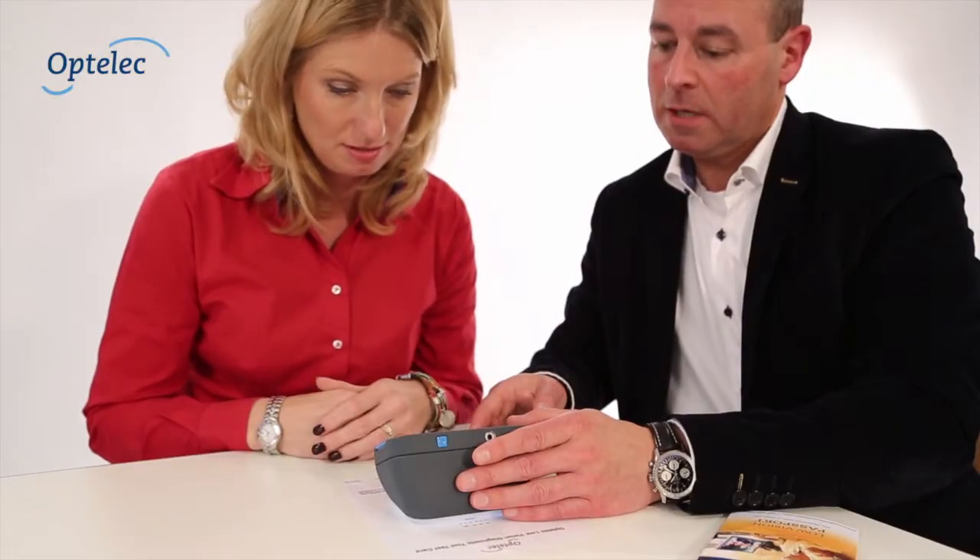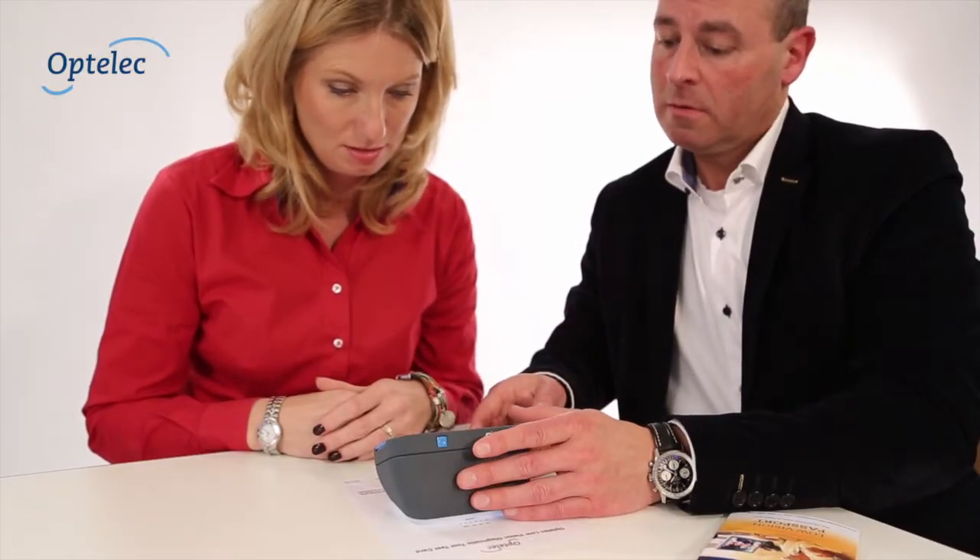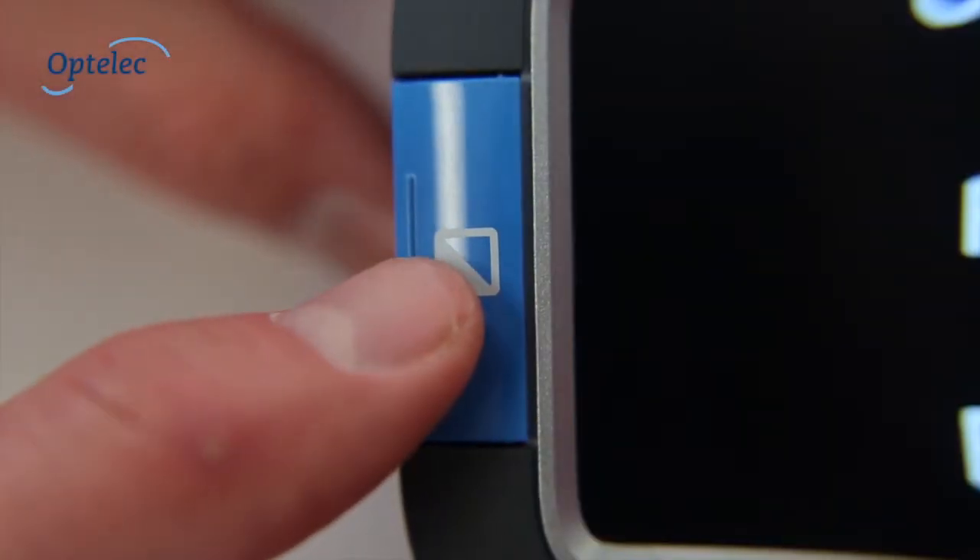Second, identify the preferred viewing mode. Keep the diagnostic tool over the text and press the mode button.